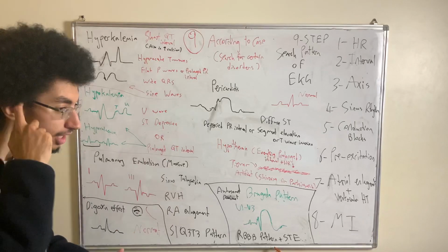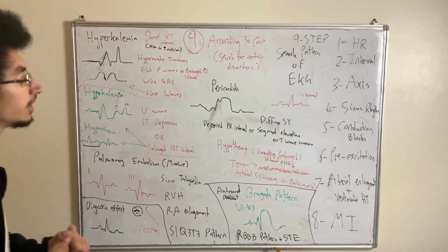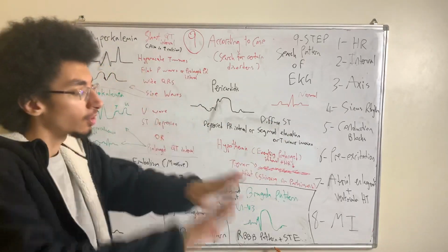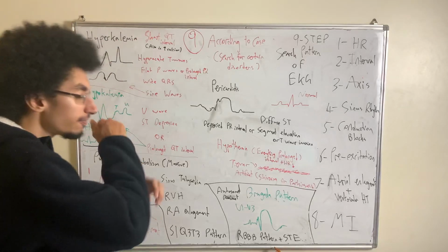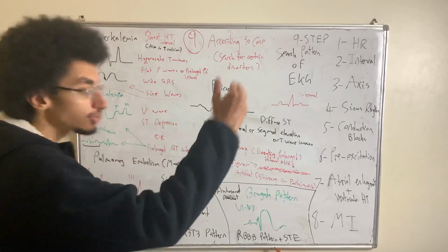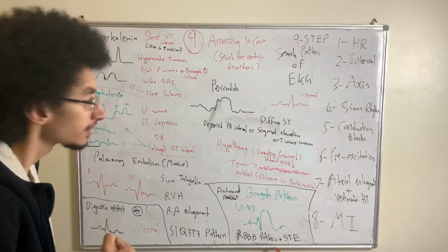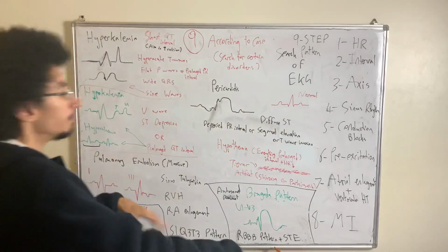But sometimes the patient is not moving. Sometimes the patient is not shivering. And if he's not shivering, then in a case of hypothermia, you might see that on the EKG reading, everything is prolonged and slowed down. What does that mean? It means that everything is slowed down in hypothermia. So you can think of it like this. If the temperature drops, everything in the EKG drops. So the heart rate may be bradycardia. The PR interval may be prolonged. The QT interval may be prolonged.